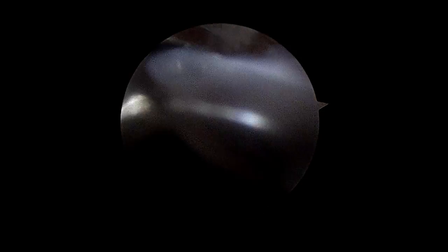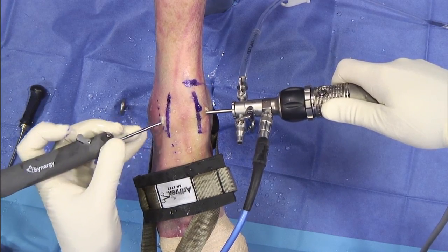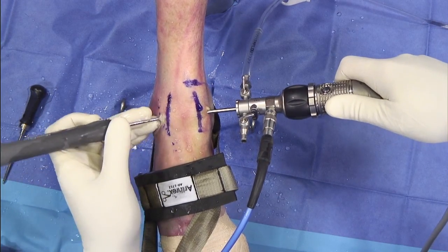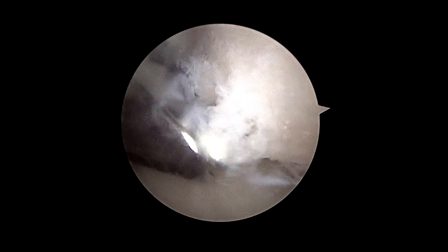The Arthrex Distal Extremity HD camera head has helped me treat my patients better. It has a lightweight ergonomic handpiece, high quality images, and allows me to see all the pathology I need to see in all distal extremity arthroscopy.